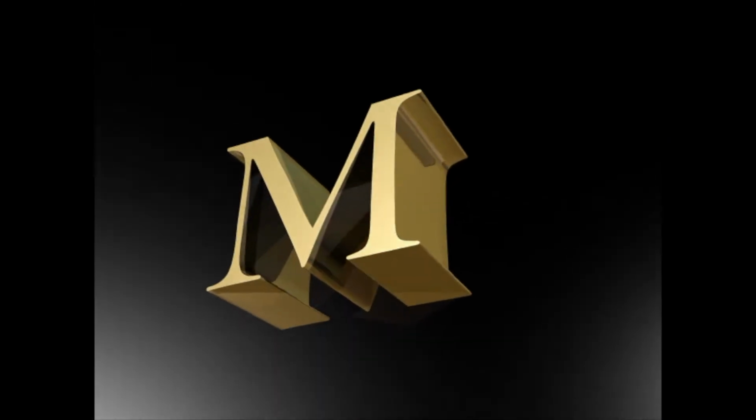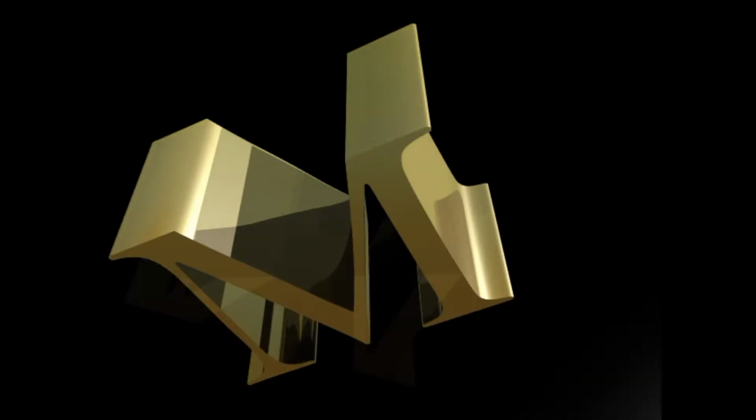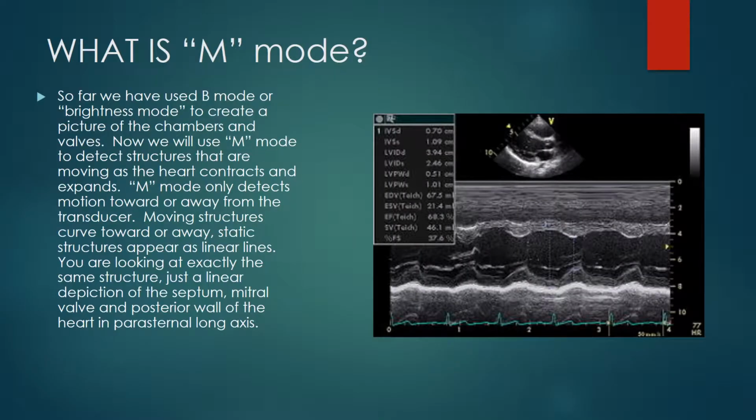Is M mode scary? No. Can you do it? Yes. Just push the button marked M. To obtain some of the data that you need, you will have to go to M mode. And this is not complicated, it is just motion mode. The machine makes a linear picture of the moving objects in front of it, and therefore it doesn't need to record as much data, and you can get a really simple picture and some measurements quickly.